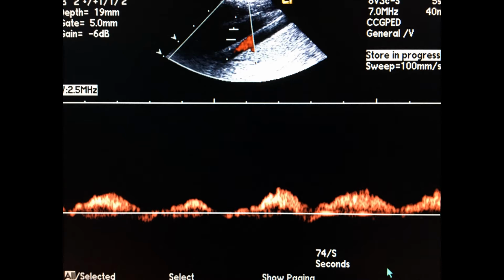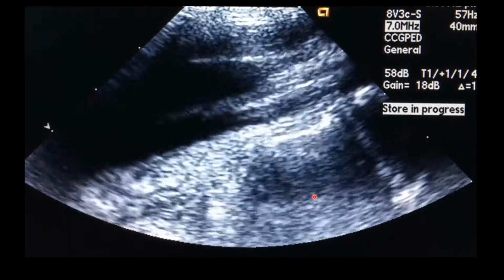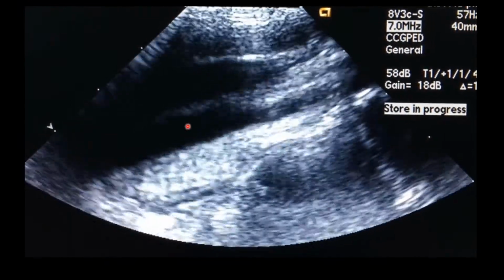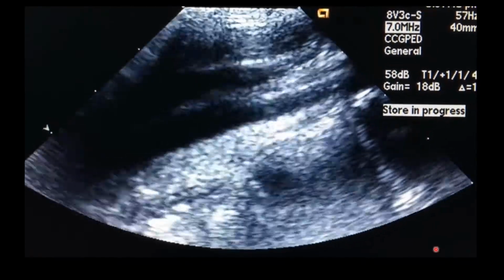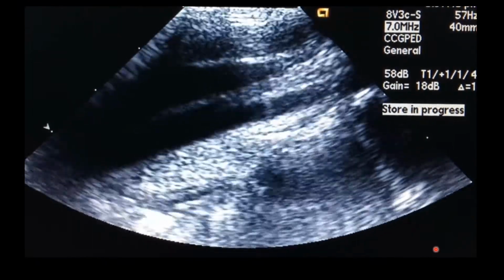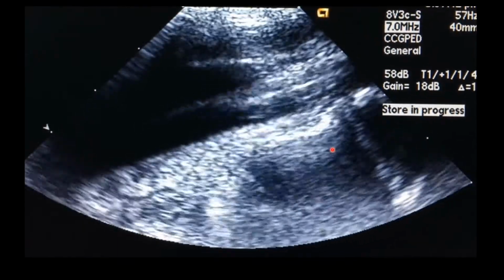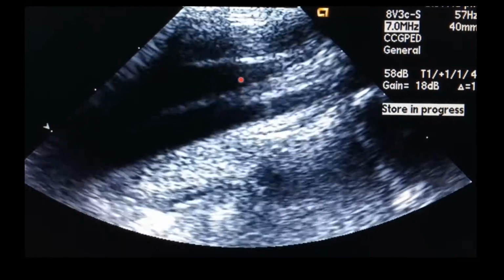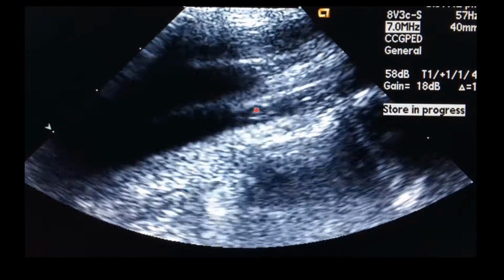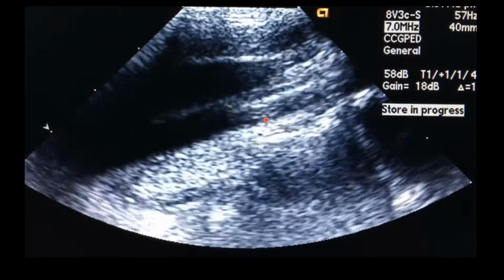Let's go over to the left side and see if we can tell anything unusual. Okay, so we've traced the blood flow. Now we're looking at the left common carotid here and the left jugular vein. It's very clear that we can't answer those questions anymore. Can you see a systolic pulse? No, not really. It's just bouncing around. The jugular vein has these massive pulsations, and that's actually pushing on the left common carotid, so we can't really see a normal pulse anymore.